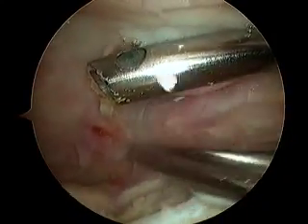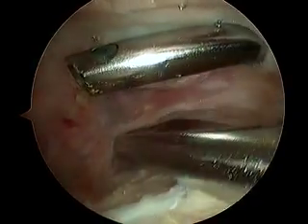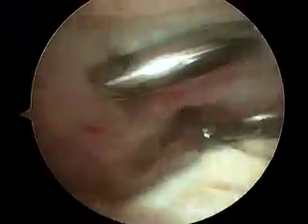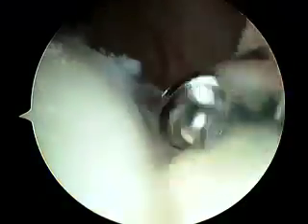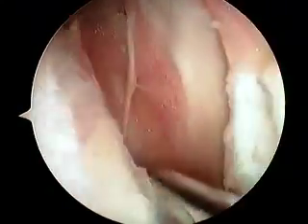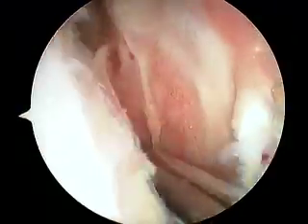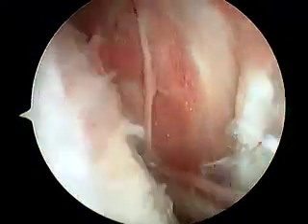We've got to get you on some medication for this too. You see how these white little specks are all throughout your knee? They're everywhere. And this reddish tissue — this tissue is normally not quite this red. This is a lining tissue we need. It's called synovium.